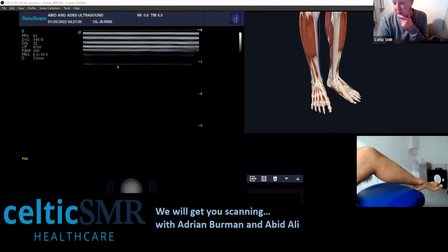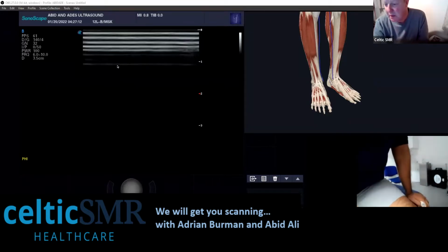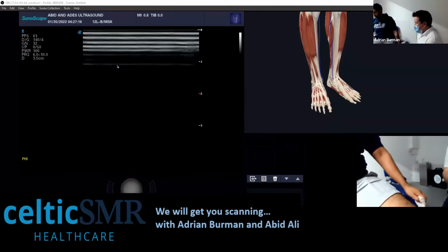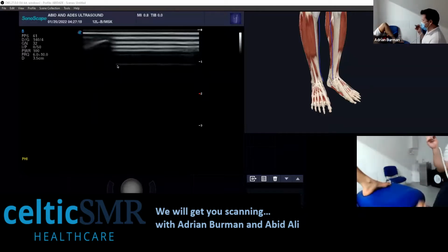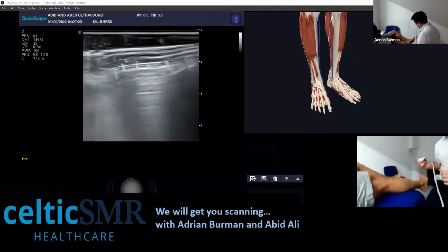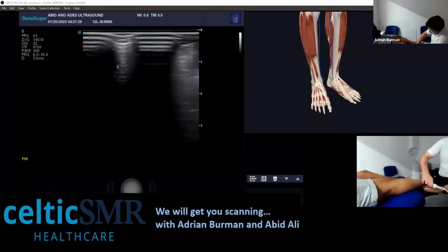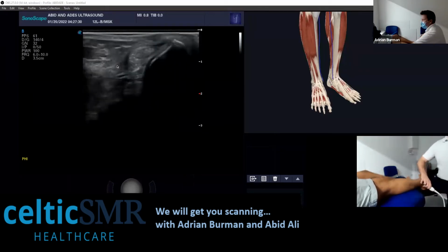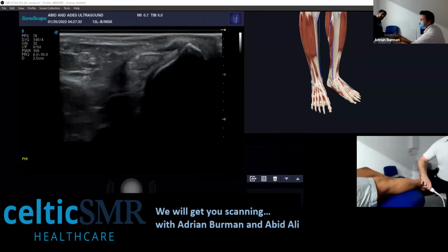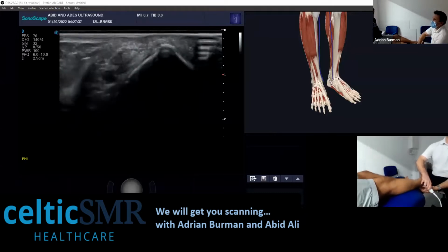There was another question from Pablo. Would you show dynamic evaluation for peroneal tendons? I think you show maybe the inversion. You're looking for snapping, that subluxing, perhaps. Yeah, exactly. So, can you do that?